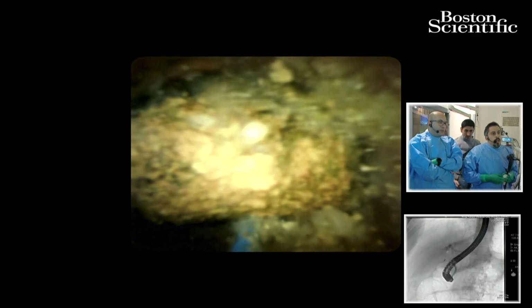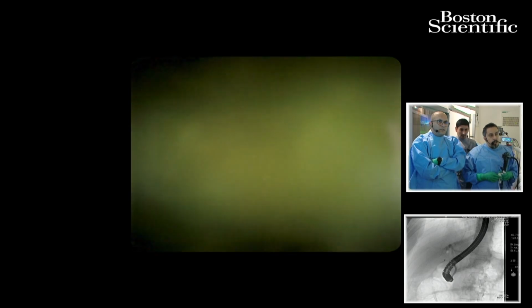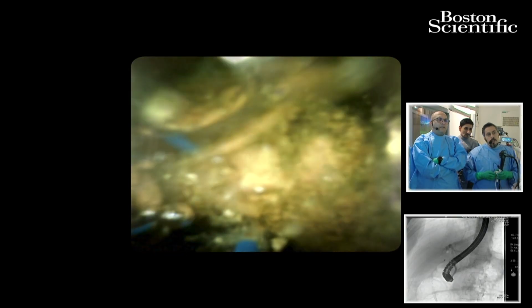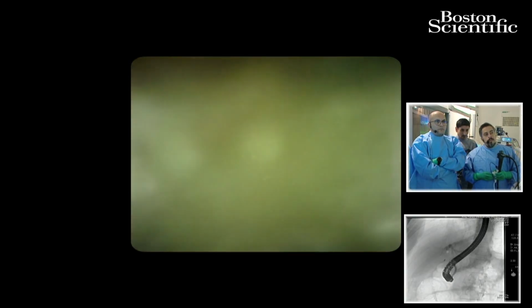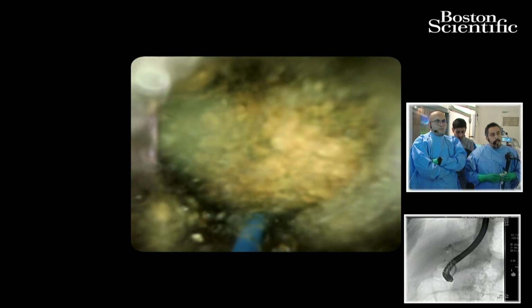Mohammed, so if I hear you correctly, you are asking about sickle cell patients, and you are asking about how to crush them through the cholangioscope, right? Is that the question? If you have right and left hepatic duct stones, for how long do you stay in one session, and how many sessions do patients with stones usually need? Do you keep the same SpyGlass for the next session, and when do you bring them back?